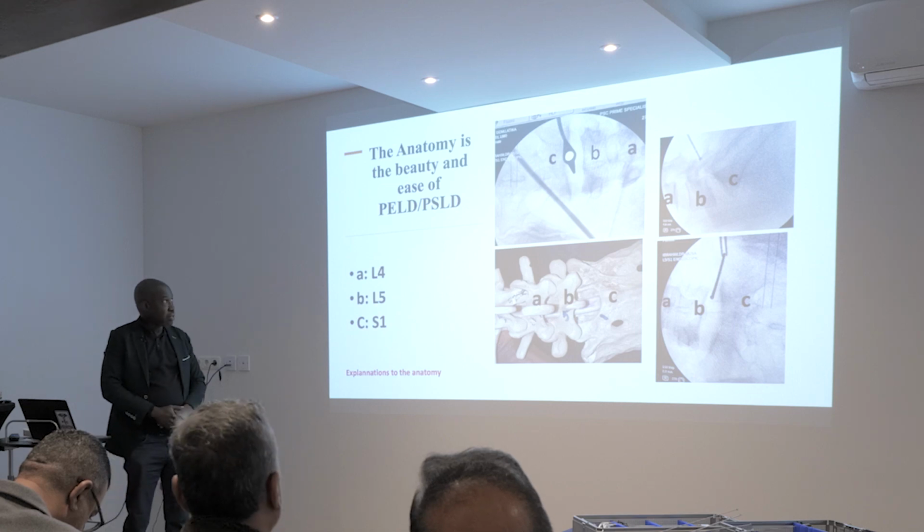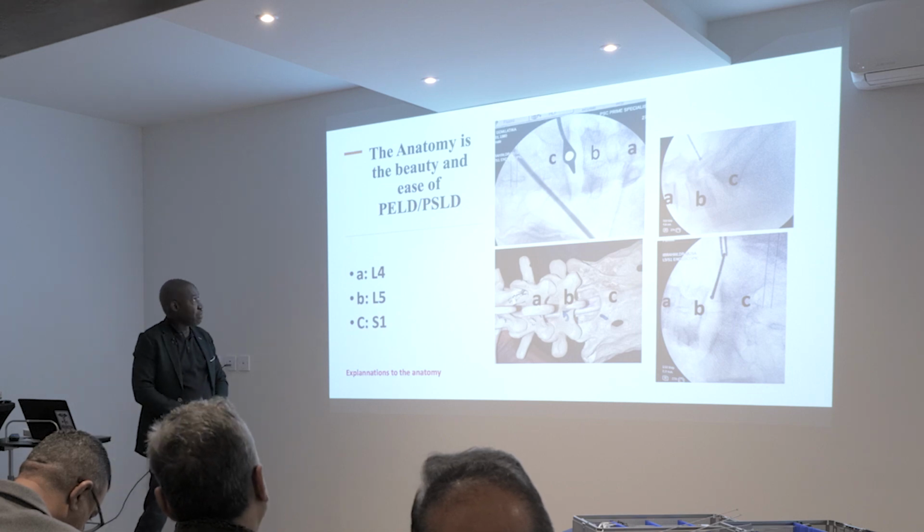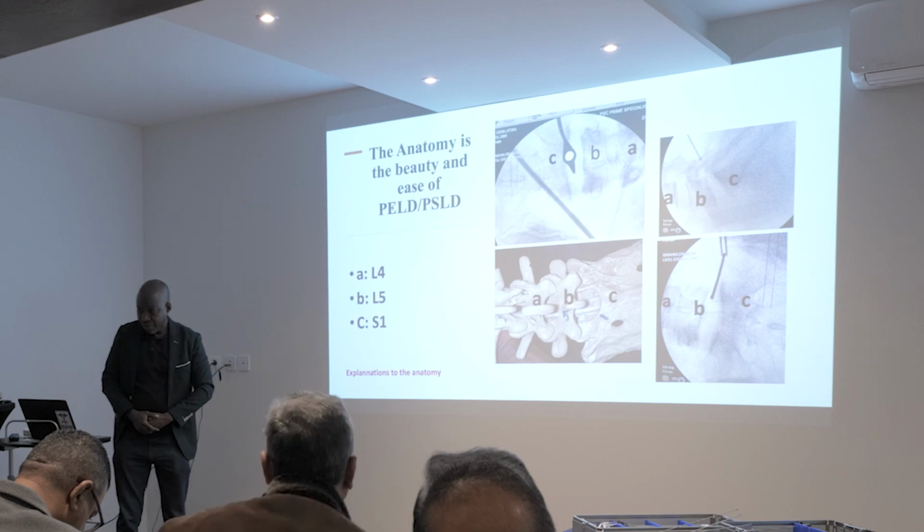Then before going into it, you have to know your anatomy very well. And the beauty of the interlaminar approach compared to the transforaminal approach, if you are an open spine surgeon, is that you are already used to the anatomy going from posterior. That's the difference from the transforaminal.